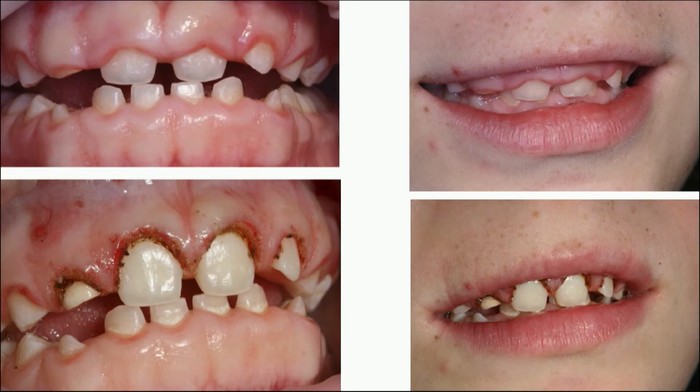And here's the neat little bit of the story. The laser tips, if they're initiated on the side, will actually cut on the side as well, which means we can do a bit of beveling, which is what I've done in this case here, just to give the overall contours the right shape. This was a simple procedure. In fact, I was training a pediatric dentist in how to use the laser, and this was a case that we did as a teaching case, but this was less than 5 minutes later. A very, very simple thing to do with very, very small amounts of injected local anesthetic.